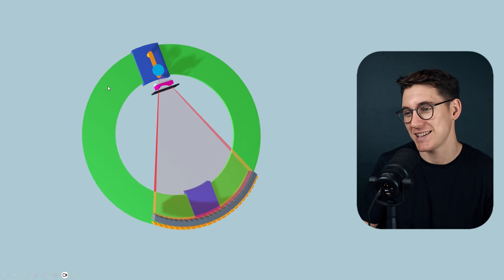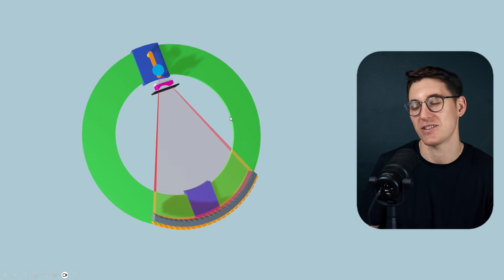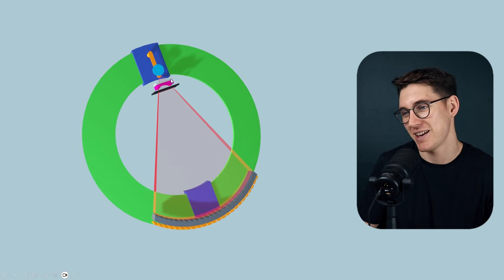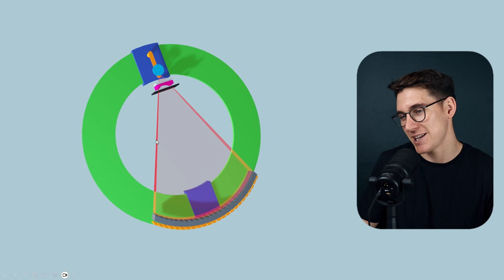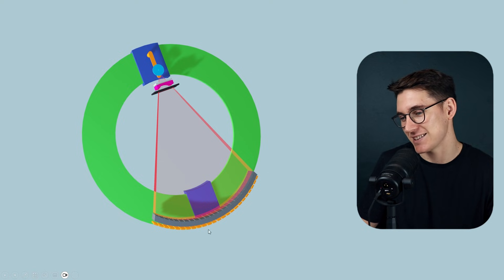If I remove this outer casing, we can see the inner workings of the CT machine: an x-ray source, the place where the patient is going to lie, and then detectors here.